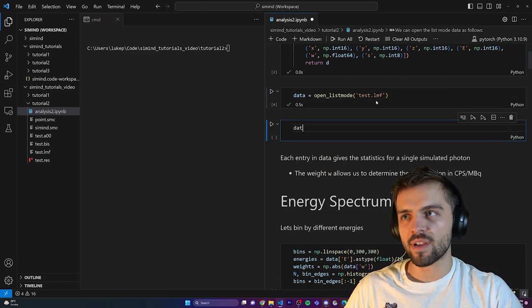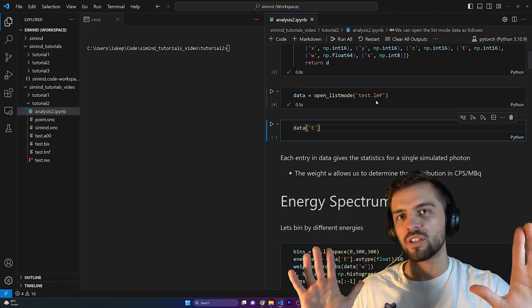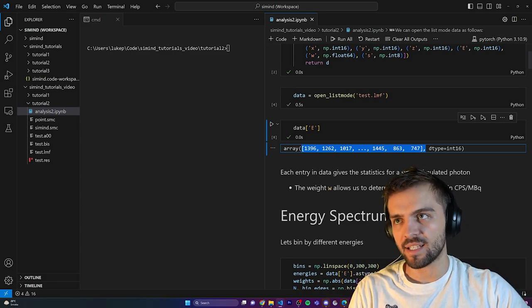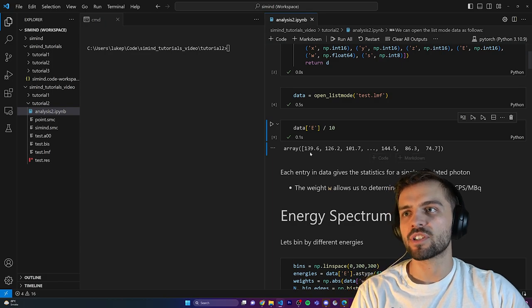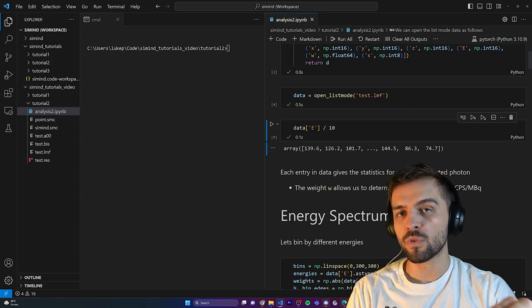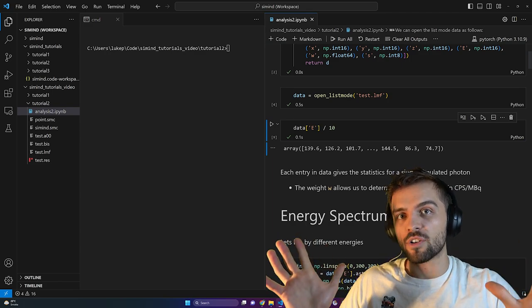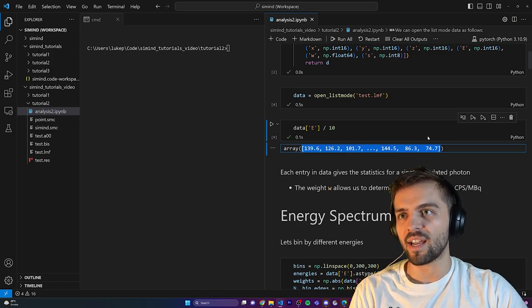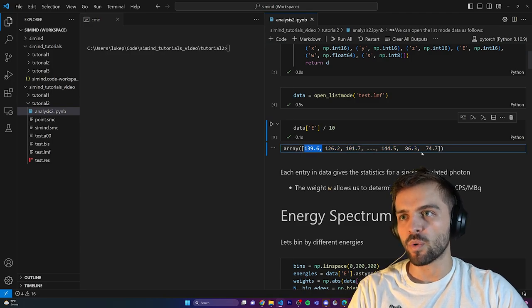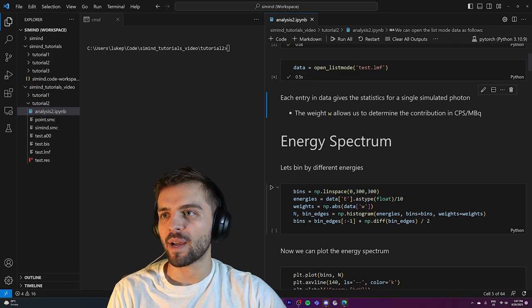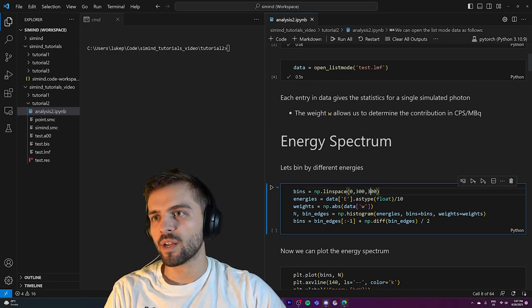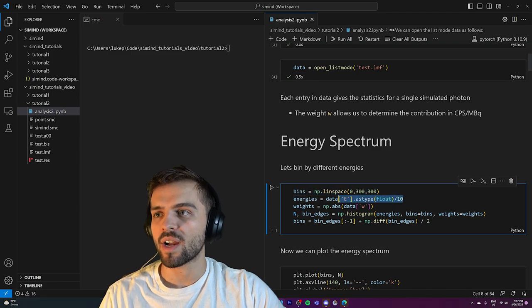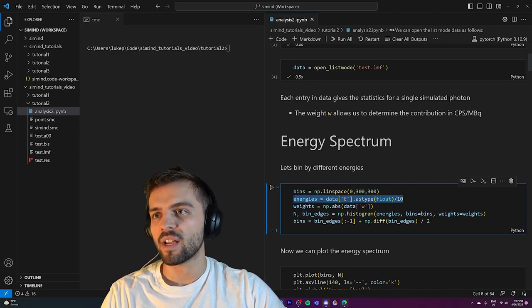The first interesting thing to look at is the energy — the energy that every individual photon deposited in the detector. I need to divide by 10 to get units of kilo electron volts. Every photon in this source has an original energy of 140 keV, but as you can see, they certainly don't all have that energy when detected — some are quite a bit less. Let's look at the energy spectrum with 300 bins, giving 1 keV spacing from 0 to 300 keV.